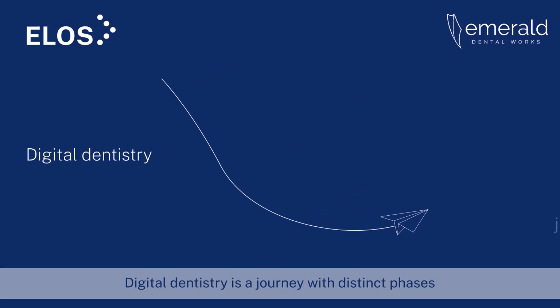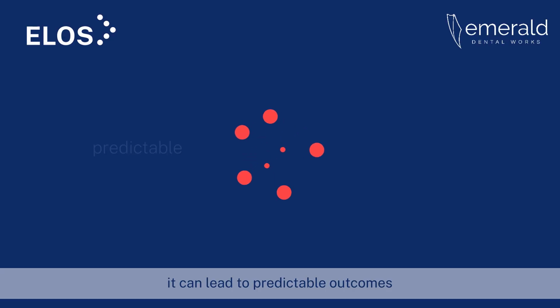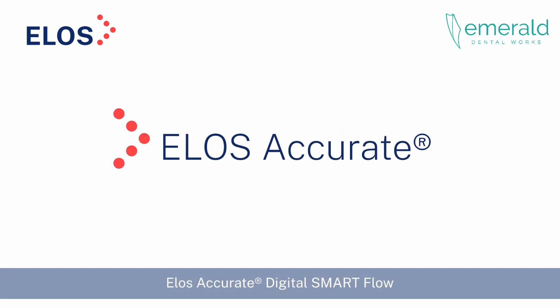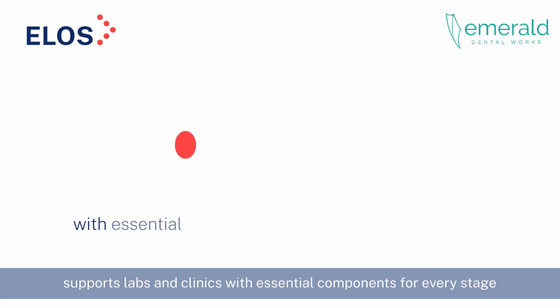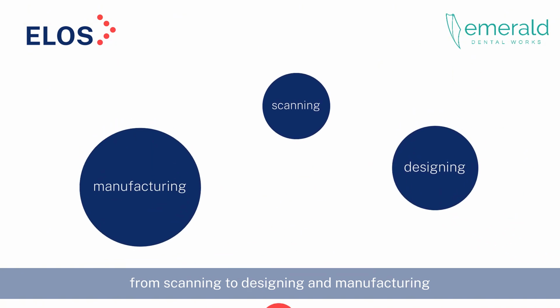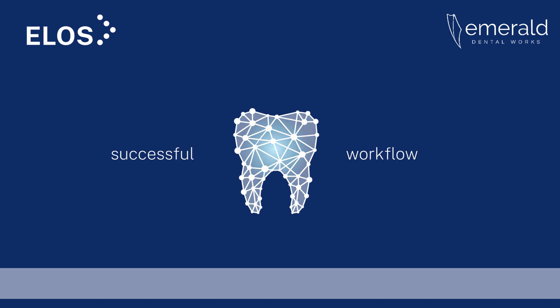Digital dentistry is a journey with distinct phases, and when executed properly, it can lead to predictable outcomes. Elos Accurate Digital Smart Flow supports labs and clinics with essential components for every stage, from scanning to designing and manufacturing. Scanning is the gateway to a successful digital workflow.